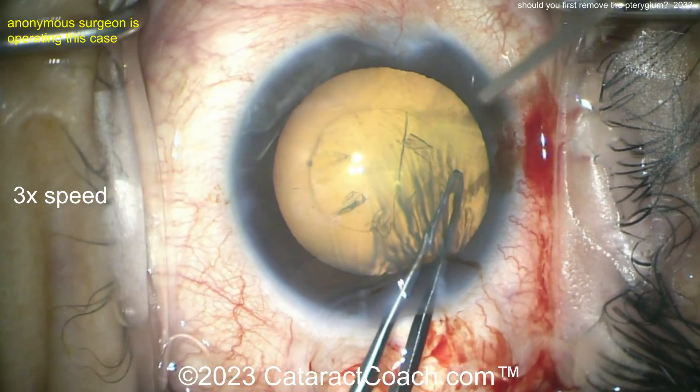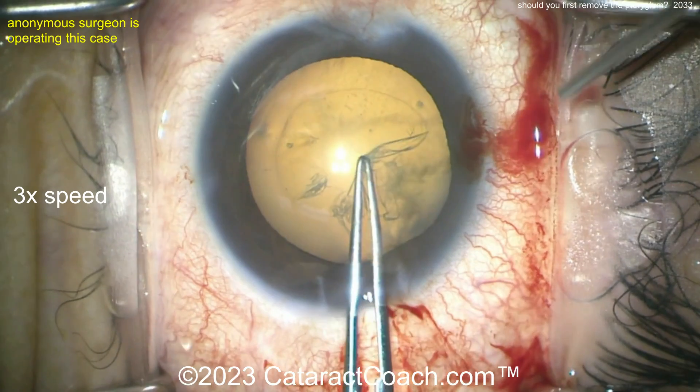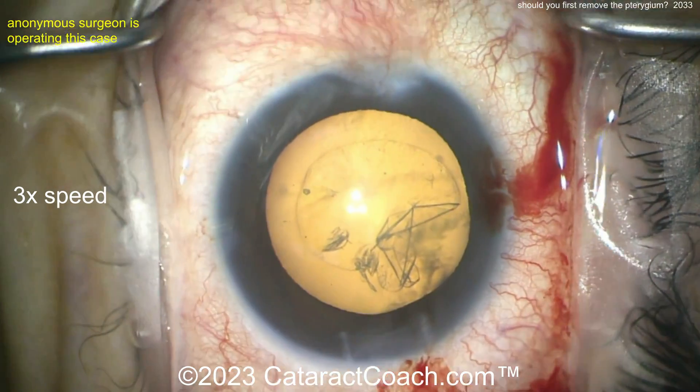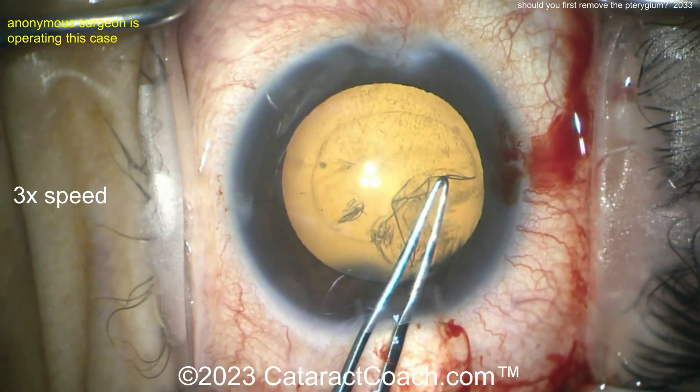So you want to take off the pterygium ahead of time and let the cornea go back to its normal shape — and that can take months, so don't rush it. Now let's see the case here. The rhexis is radializing a bit — come on, young doctor, let's get that rhexis fixed up. A little rescue maneuver there — nice, back on track.